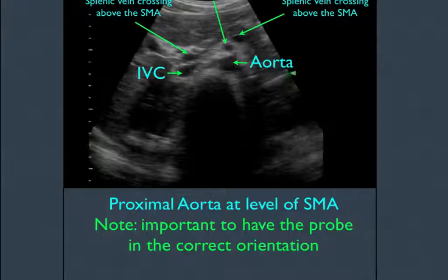Superior mesenteric artery. And that's been described as a mantle clock. So if you think of a clock that sits on a mantle with a little face for the clock, the face is the SMA, and the mantle shape is the fat around the SMA.